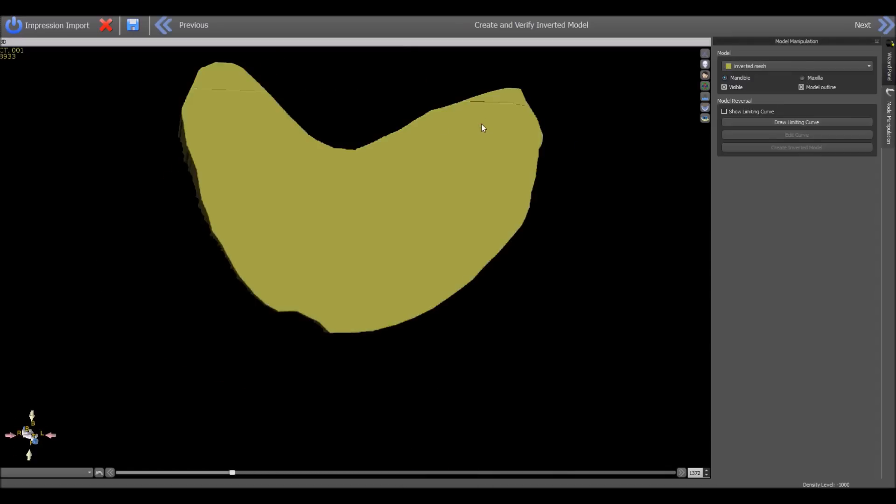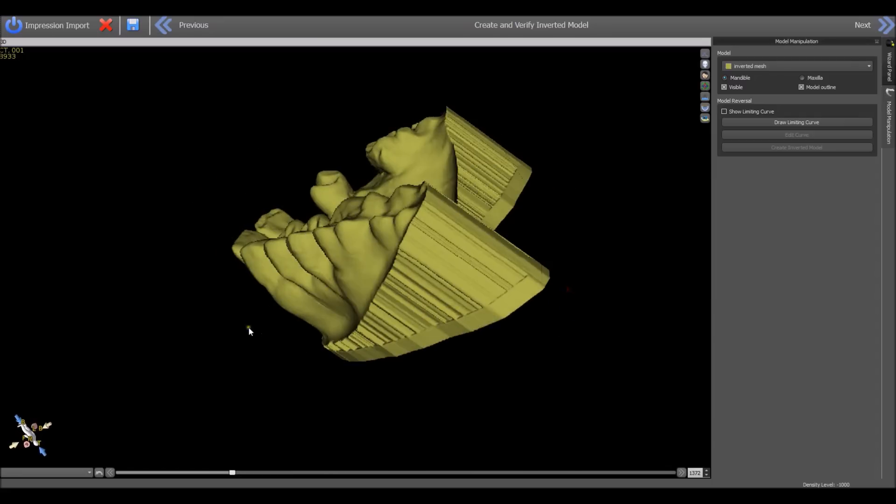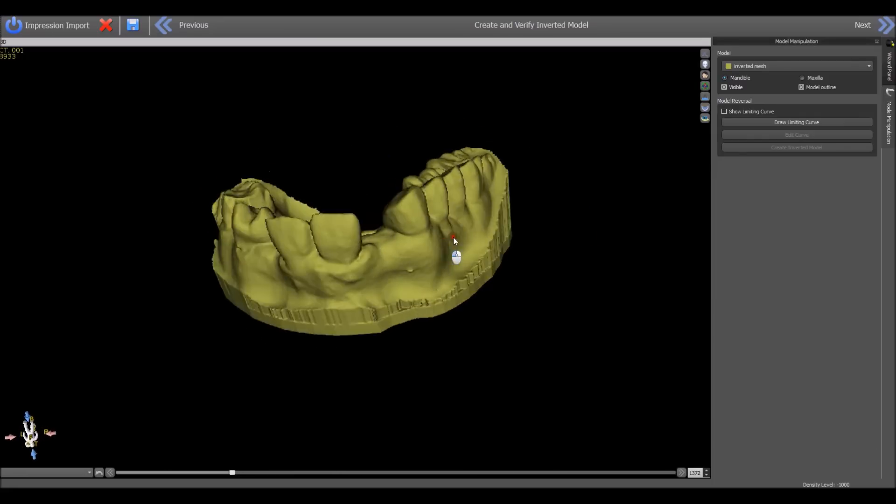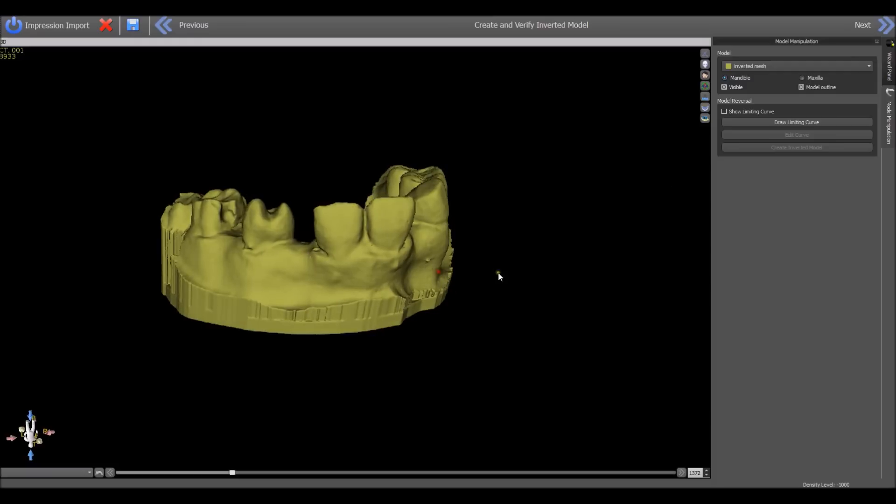The software has now inverted the impression into a model, and we can see it on the screen. We continue with the process and click next.